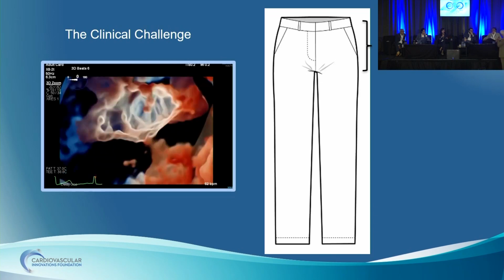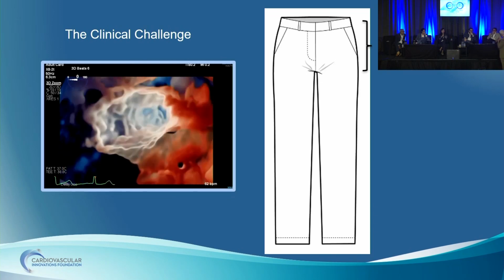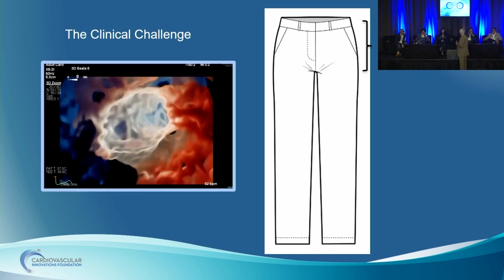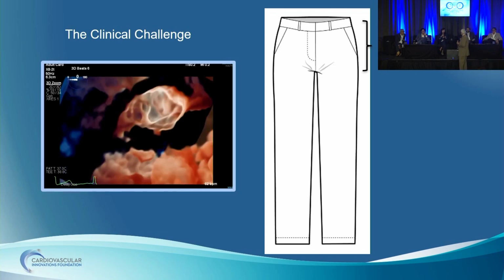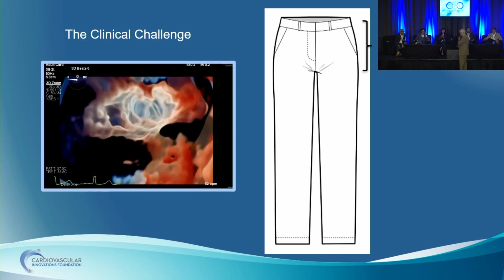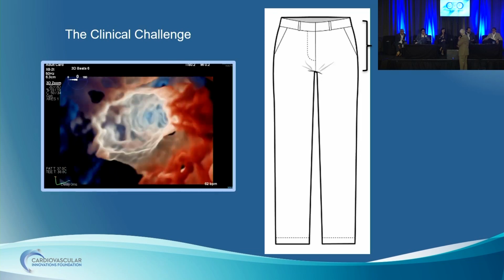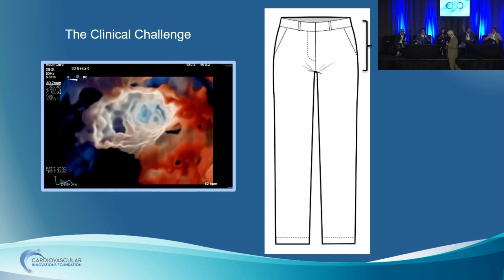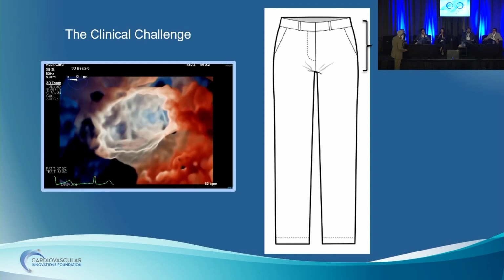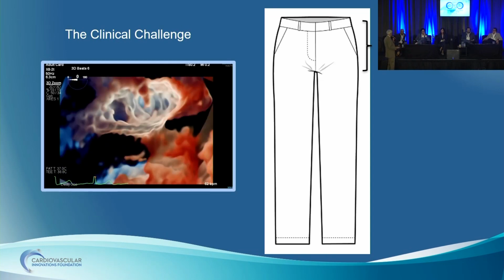Anyone else have any notions what we should do? Because I had one where we had something similar. How about putting two devices? Good idea. Because I think, actually looking at this, yes, this is the only solution. Exactly, where you put two, and there were case reports of it actually, and you sealed both lobes. So that's exactly what we did.